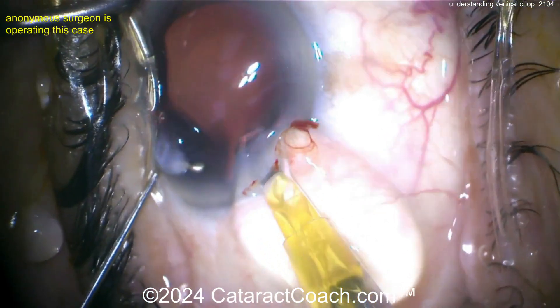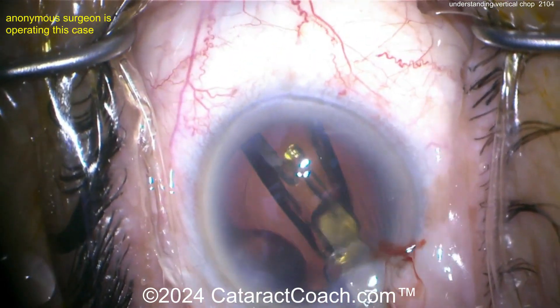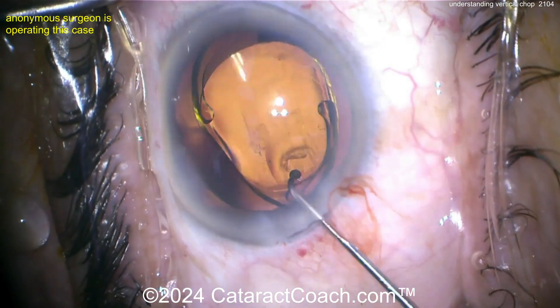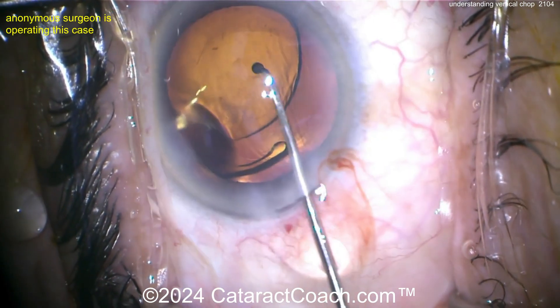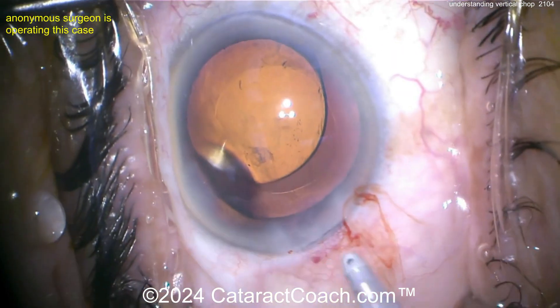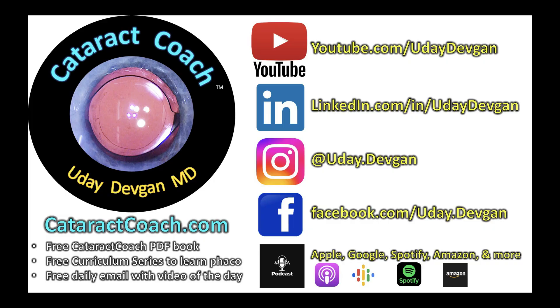The surgeon switched to a ball-tip chopper to deliver the IOL into the capsular bag — nicely done. Remember, visit CataractCoach.com, use the search function, and explore the curriculum series to learn how to become a phaco chop surgeon.